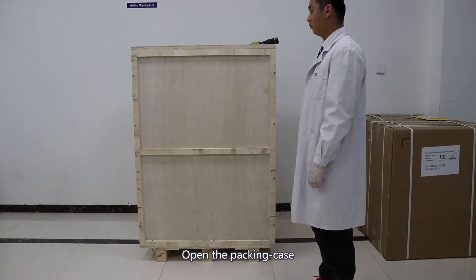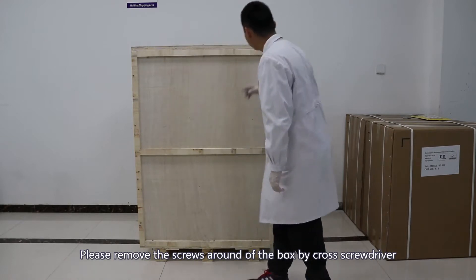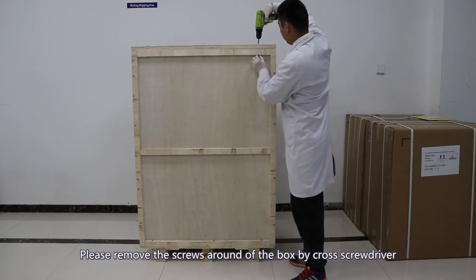Assemble demo. Open the packing case. Remove the screws around the box using a cross screwdriver.